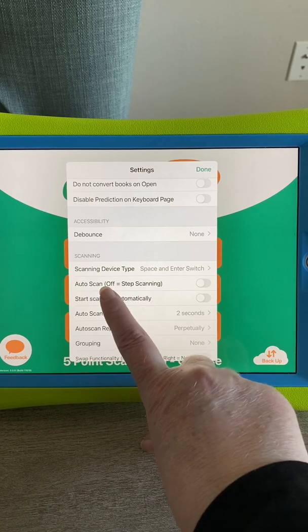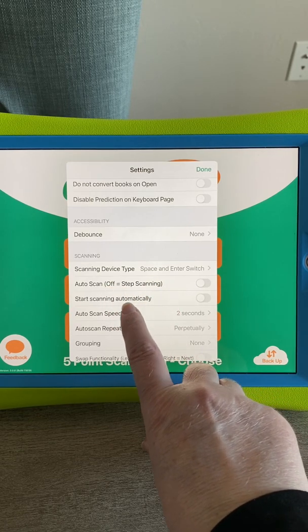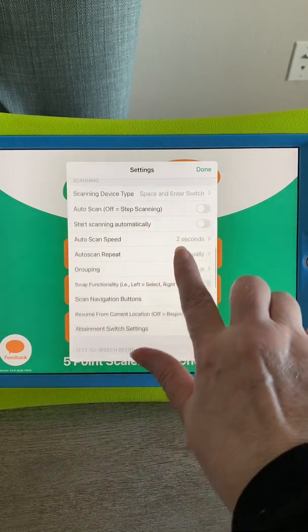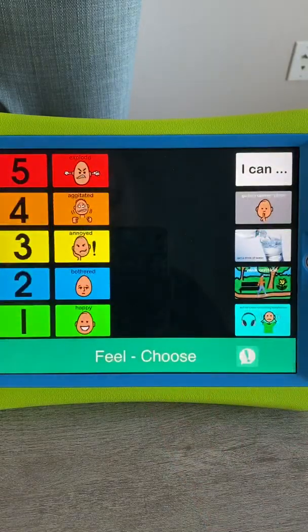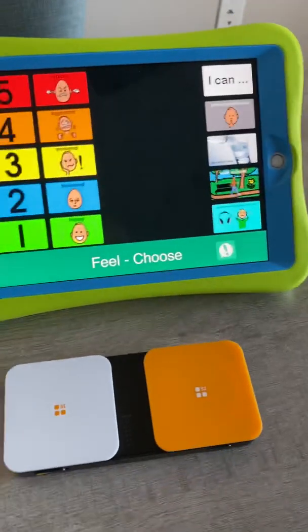If you want it to automatically start the scanning, you can do that. You can also adjust your speed, grouping, and so on. But for right now, I'll back up a little bit.